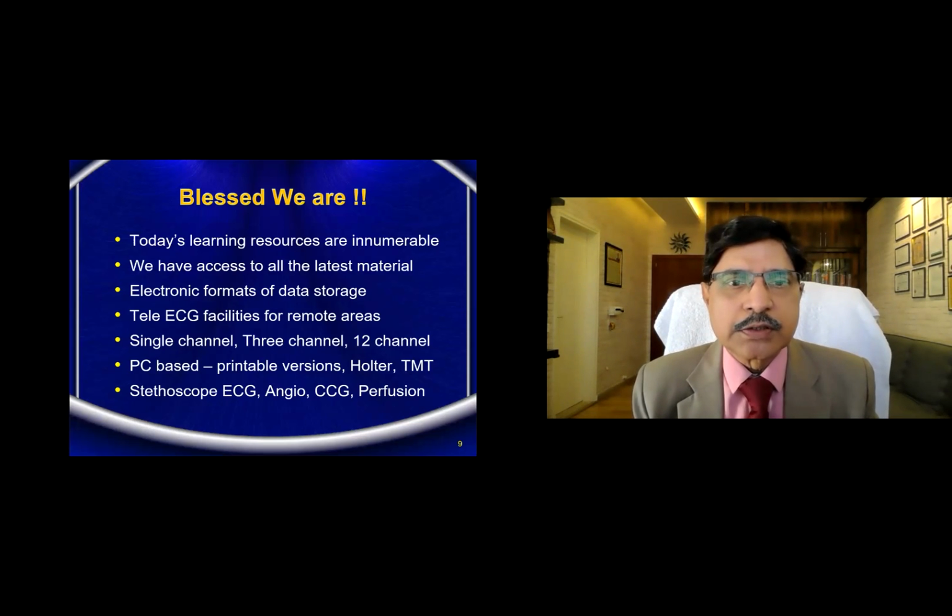Today's learning resources are innumerable. We have access to all the latest material. Electronic formats of data storage are there. Tele-ECG facilities for remote areas. Single channel, 3-channel, multi-channel, PC-based, printable versions, Holter, TMT, stethoscope ECGs. I have one stethoscope like that, which demonstrates the Littmann stethoscope. Just place on the chest and it gives the ECG.